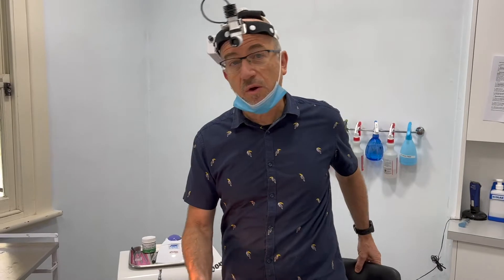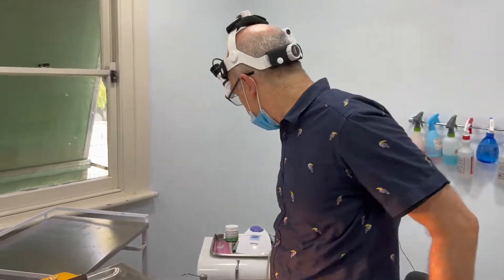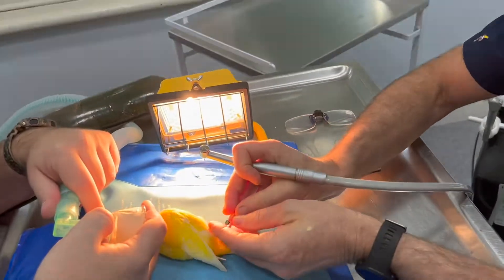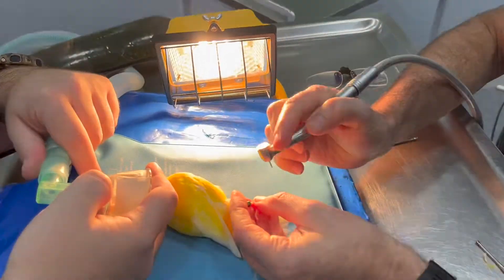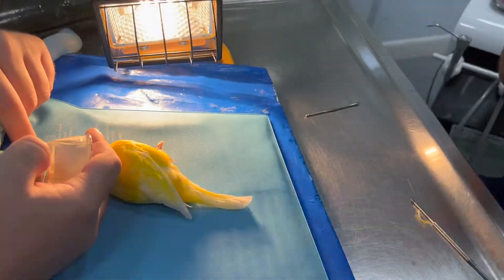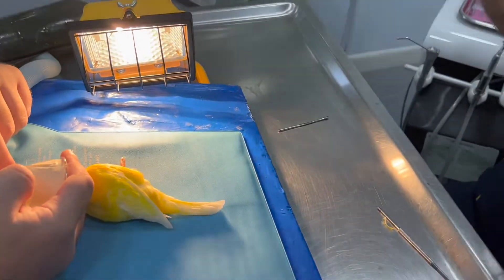So we anesthetize it. I know a lot of you watching will have taken the leg band off yourself, but not for all the money would we take a leg band off without an anesthetic. As you can see, we're going to be cutting it off with a diamond burr, which is very safe.